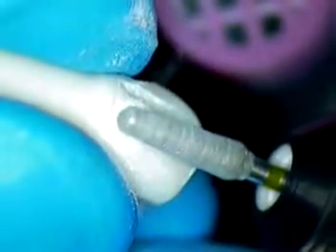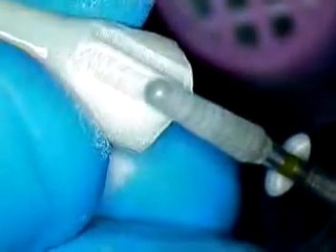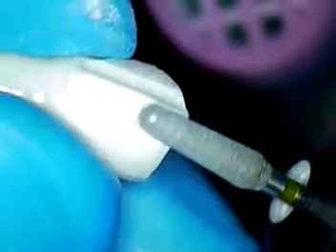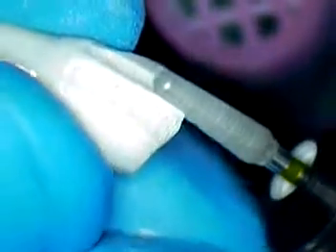Now step two — let's do our vertical cuts. Depth cuts are important, and try to get your depth cuts close to each other as you're reducing the three planes. The first plane is gingival, then the facial. Notice I'm not completely sinking the burr all the way in the way I did with the posterior teeth. You need a little less — about 1.25 as you get toward the incisal, and right at the gum line is going to be maybe even a half millimeter to almost a millimeter. Just progressively remove the tooth structure; start with the toe of the burr, then extend the rest.